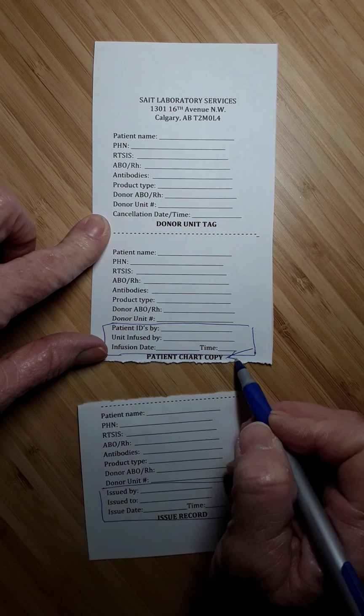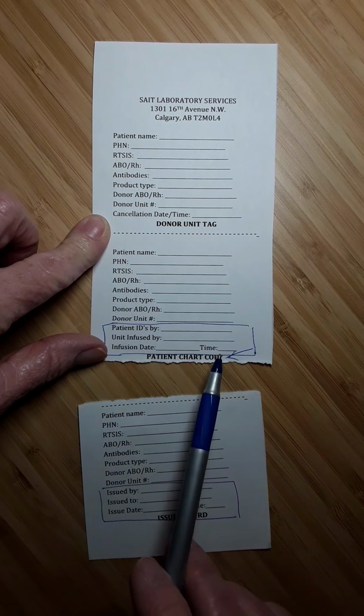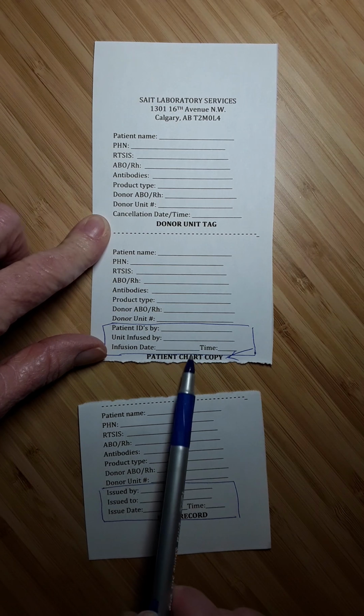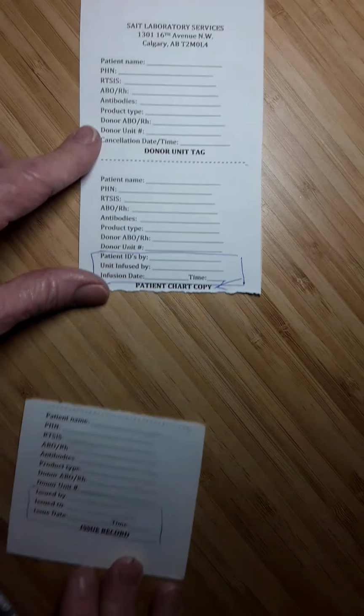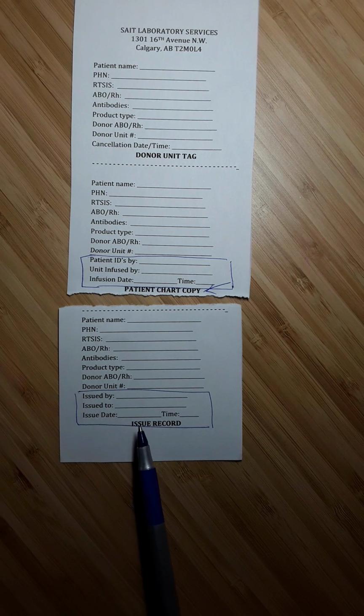Well, on the patient's chart. Okay, so as a record of the unit that was transfused into the patient. This top portion of the tag will remain on the unit of blood while it is being transfused into the patient.